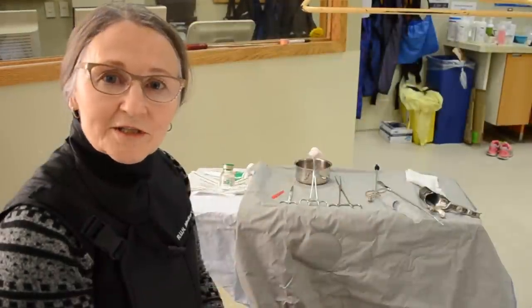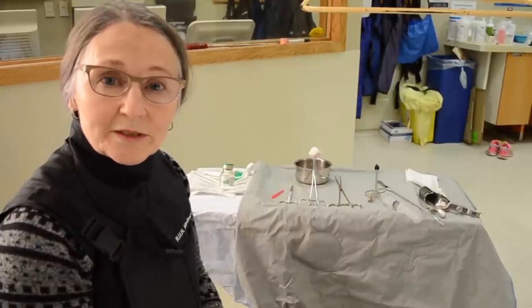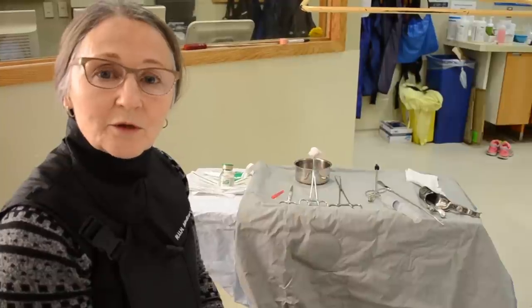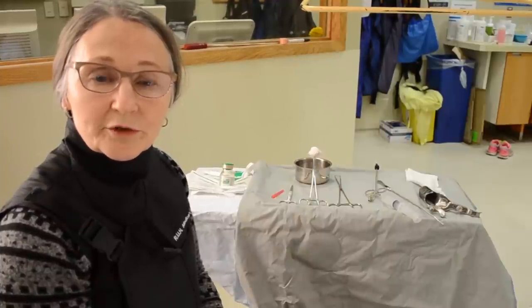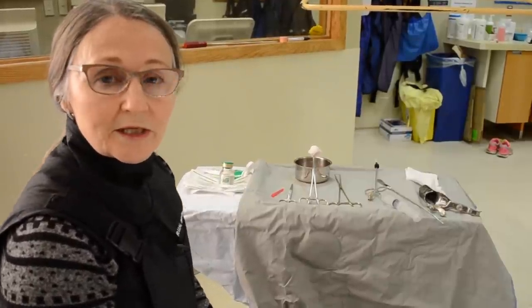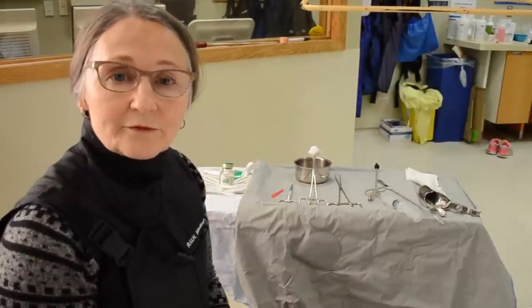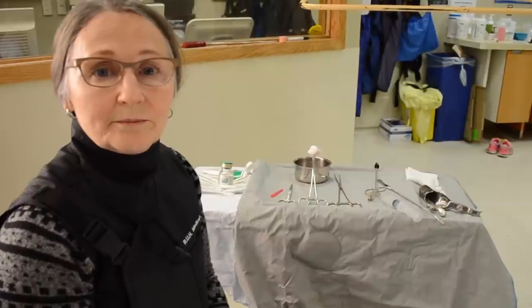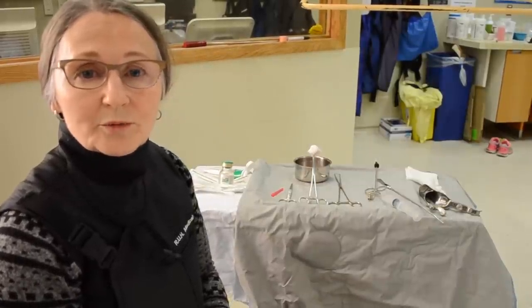Hi, I'm Dr. Donna Chisholm. We're at Royal University Hospital in the fluoroscopy suite in the radiology department. We're just getting ready to start with a hysterosalpingogram. We are using a hysterosalpingogram to investigate for patency of the oviducts, the fallopian tubes, and also to see if there are any polyps or fibroids.